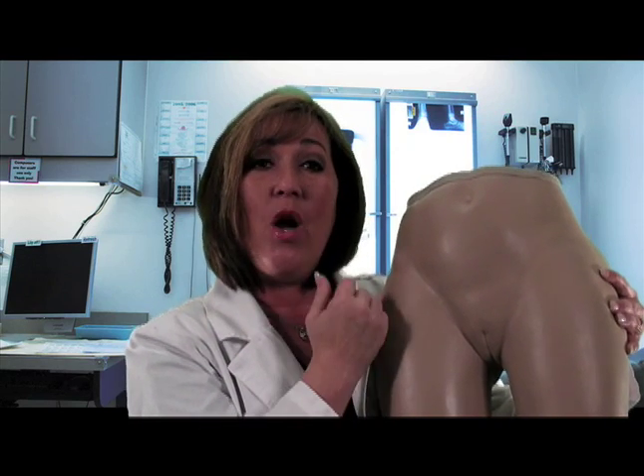Always make sure that you find out from the patient where they had their previous injection. Now, let's talk about what supplies you're going to need for this particular procedure. This is a non-sterile procedure, so just clean gloves are going to be sufficient. You need your medication — we'll assume that the syringe is already filled. And you need your alcohol prep pad to rub the site.